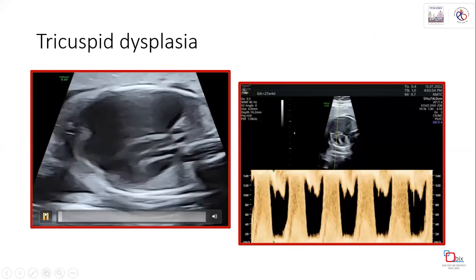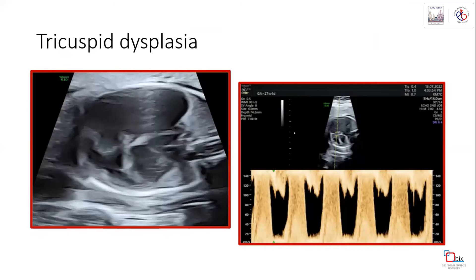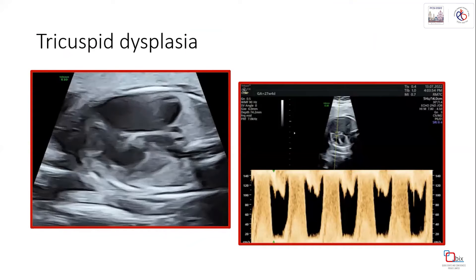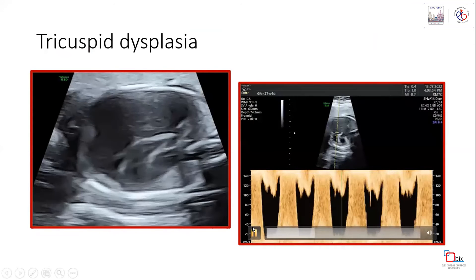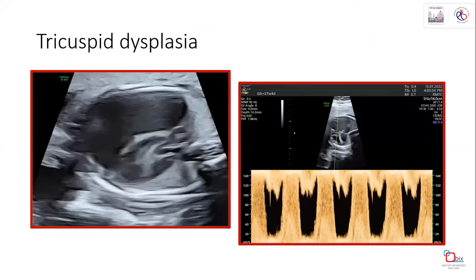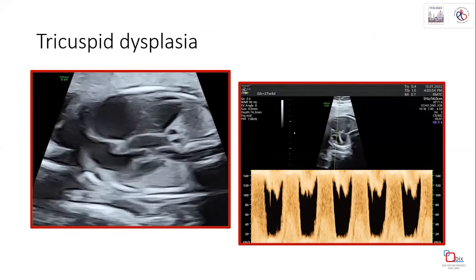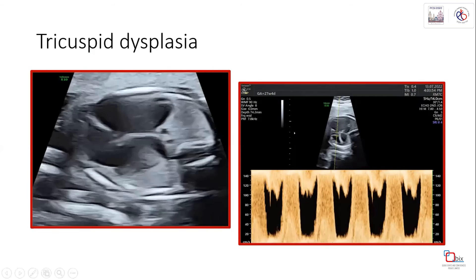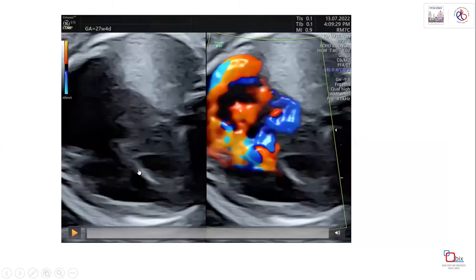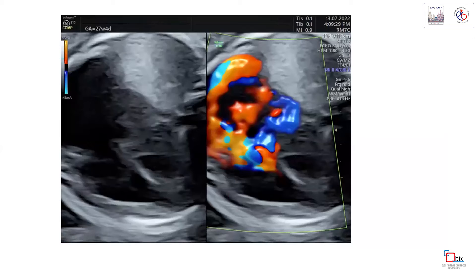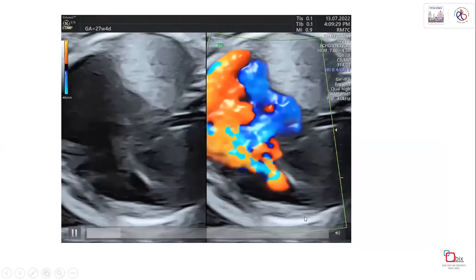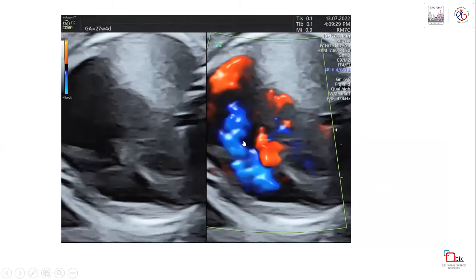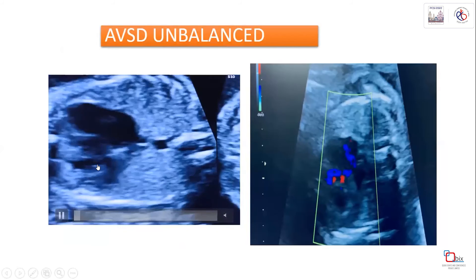This is a case of tricuspid dysplasia. The tricuspid valve is not moving toward the apex - it remains in place with a dysplastic valve. The peak systolic Doppler velocity was above 140 cm/s, causing right atrial enlargement. The color flow jet is seen midway rather than directed toward the apex, showing a gross disparity between the mitral and tricuspid inflows, confirming tricuspid dysplasia.